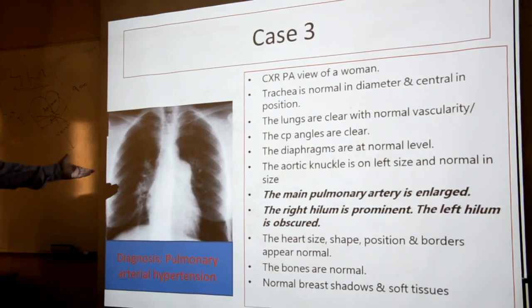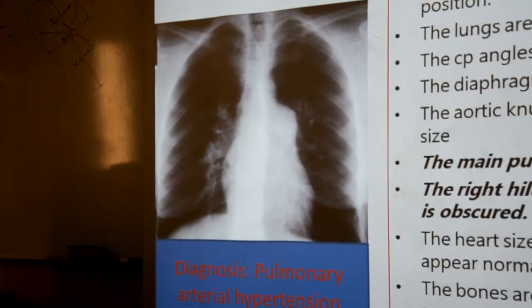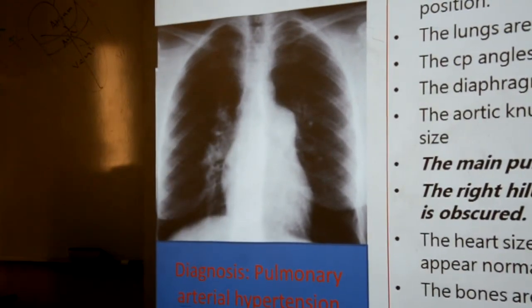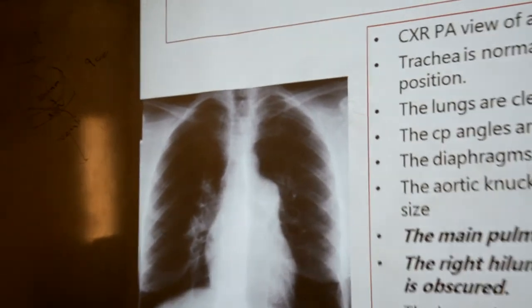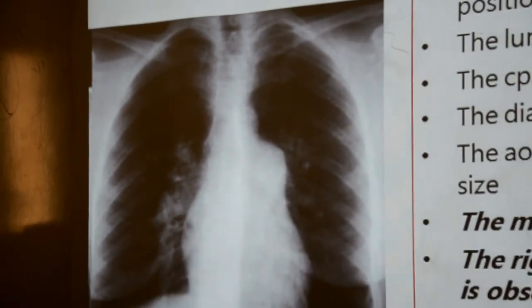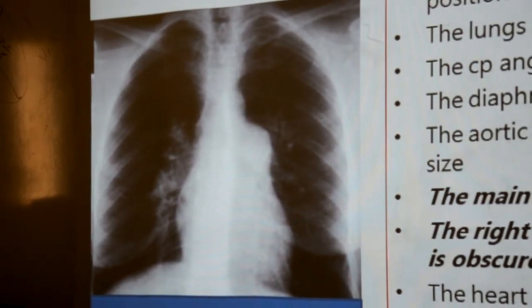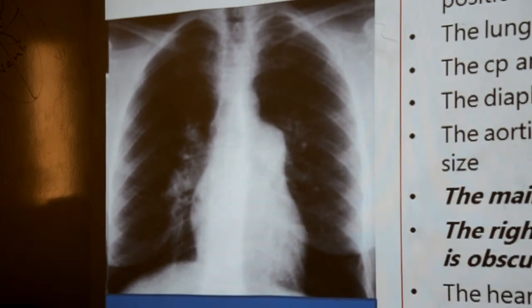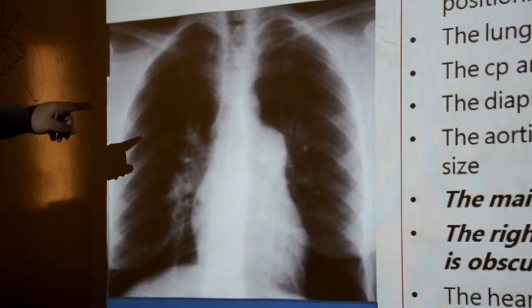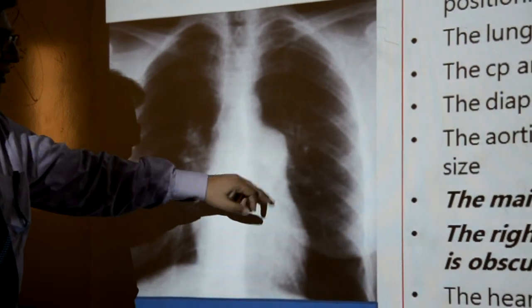Okay, I will describe it. Chest X-ray PA view, with slightly disturbed centering because the medial end here is slightly narrow and it's a wider, slightly tilted film. There is overexposure of the film because the lungs look more black and lucent. The trachea looks central. If I compare symmetry, it's almost okay apart from the opacity because of the pulmonary hila. It is large. The other prominent thing is that the main pulmonary artery is too bulky.